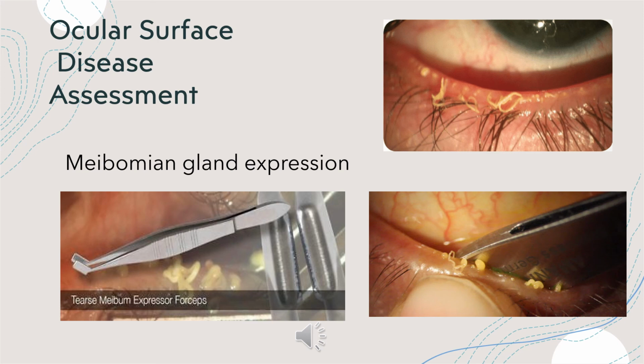Then from all the measurements, we determine the best line of treatment. The dry eye assessment generally takes 45 minutes to an hour. Your eyes will be mildly red and lids slightly achy for the day following the expression. 24 hours later, you will start feeling better. Plan your day accordingly. Do not wear eye makeup for this procedure.